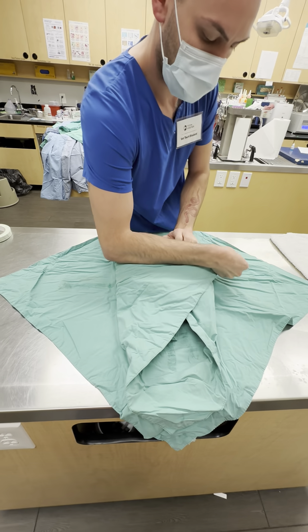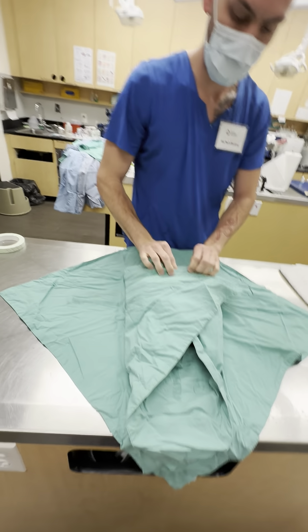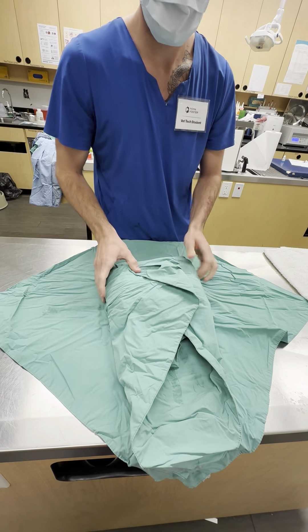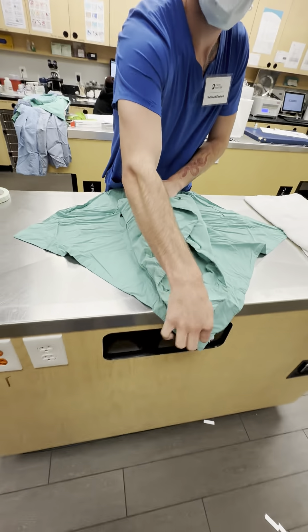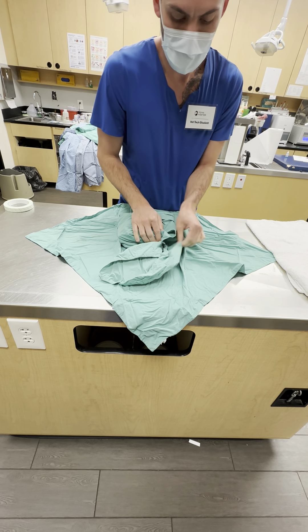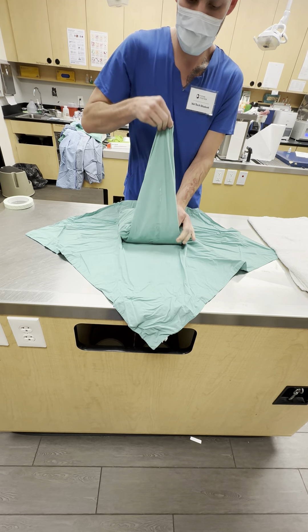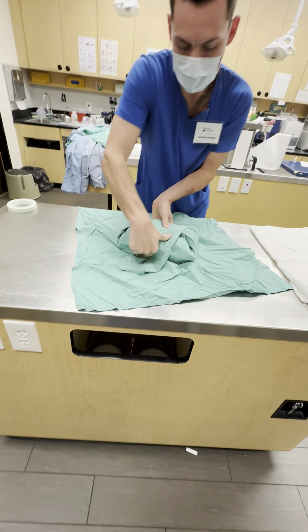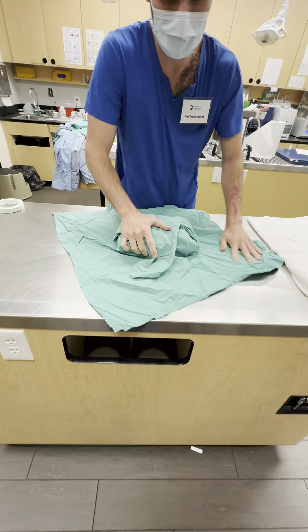There you go. I'll just make sure that covers that. Spin her around and pull her towards you.